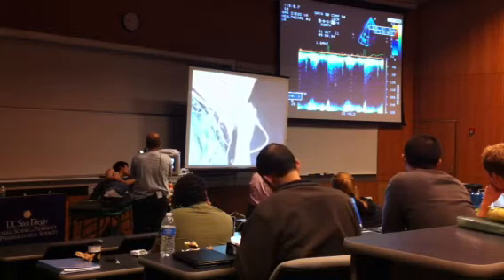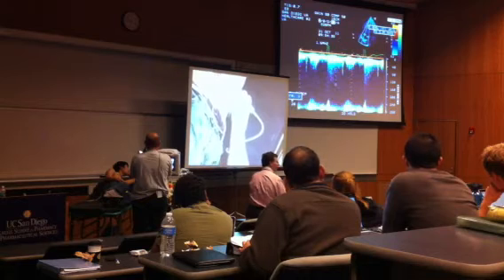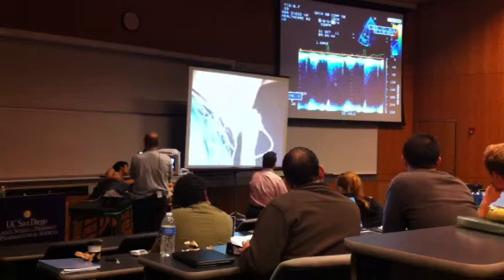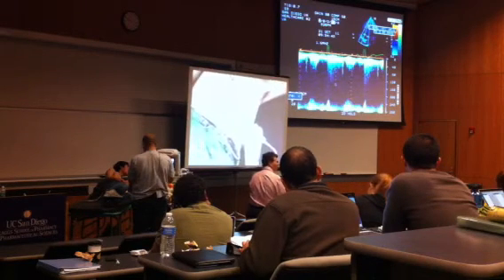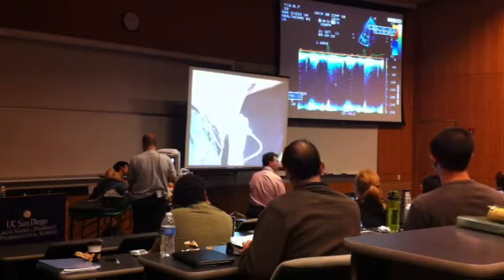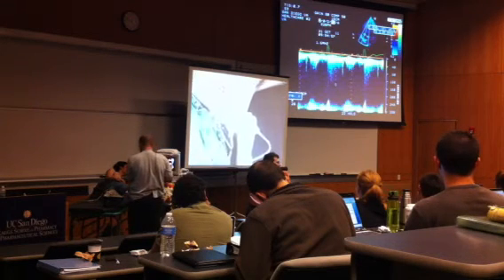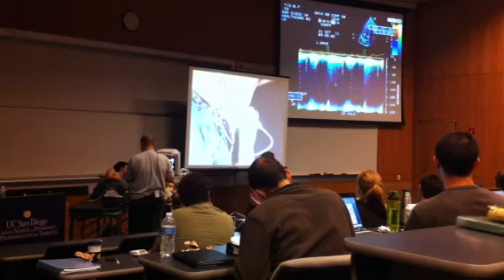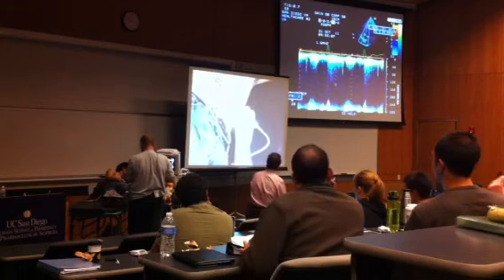For that blood to come back into the atria, the pressure has to exceed the resting pressure in the right atria. And so let's say it's 5. We have to add 5 to, in this case, the 9.86 that we're measuring. And we'd say that the peak systolic pressure in the right ventricle is quite low. It's about 14 to 15, well within the normal range, not elevated. In a patient that had elevated pressures, this would be very useful because we can then determine that.